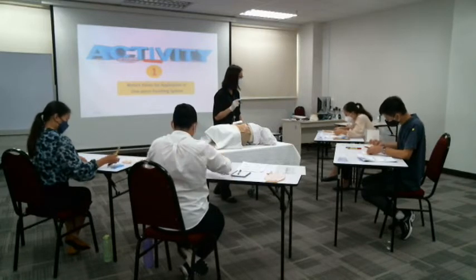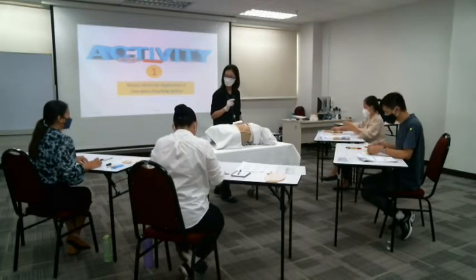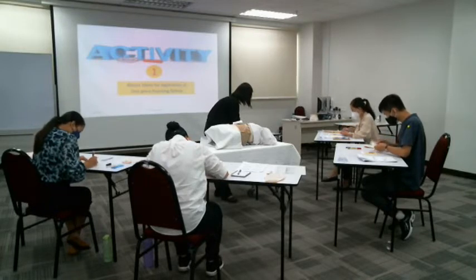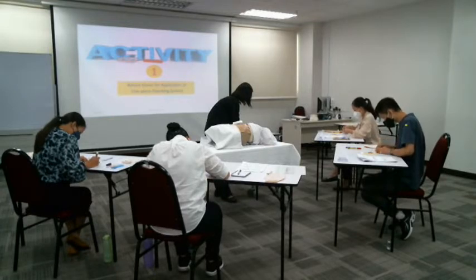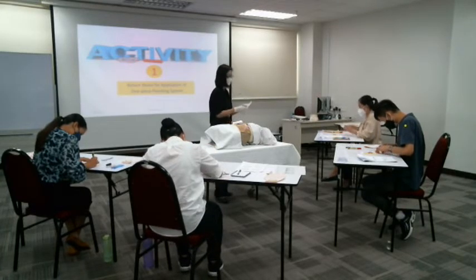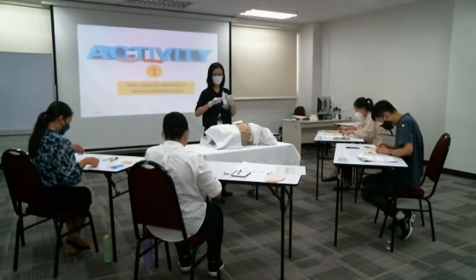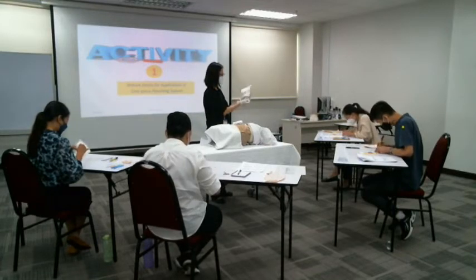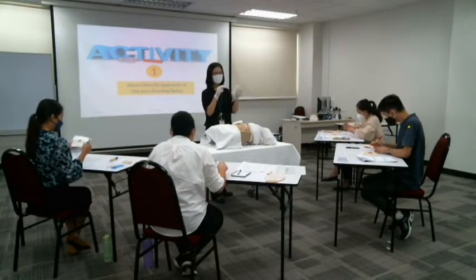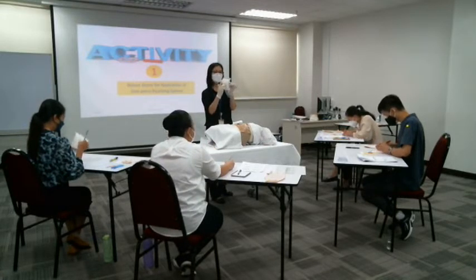Everybody get the correct size? And okay, so trace it on the colostomy bag. Trace the size. Right, good. So you have placed the size on the colostomy bag. Now you put in just a little bit of air so that it won't attach together.